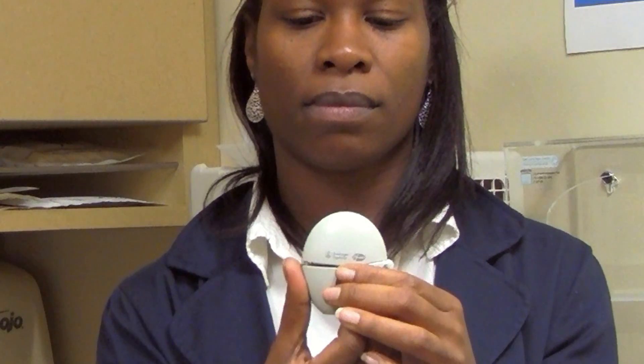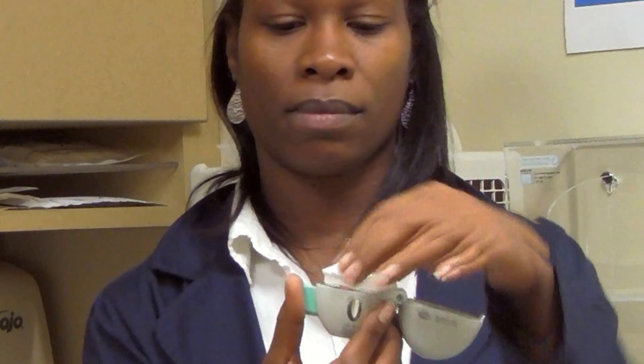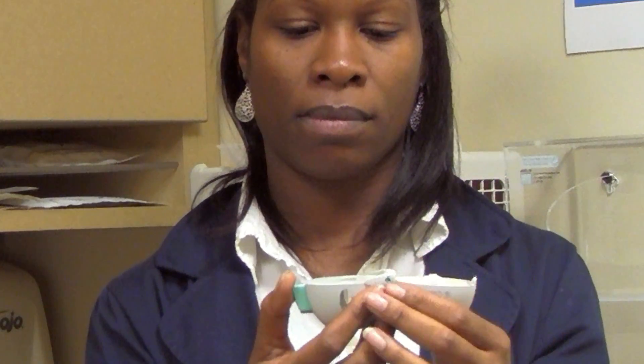Hold your handihaler and open the dust cap while pressing the green button on the side. Open the mouthpiece by pulling up on the edge from the base. You will see the center chamber where to place the capsule.